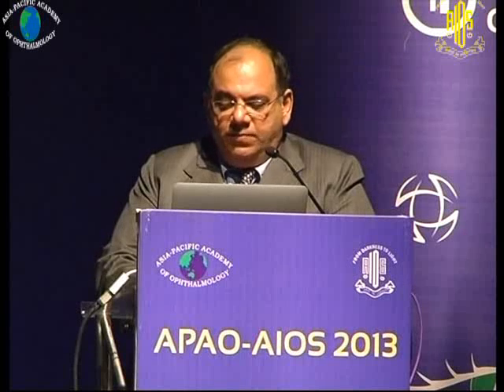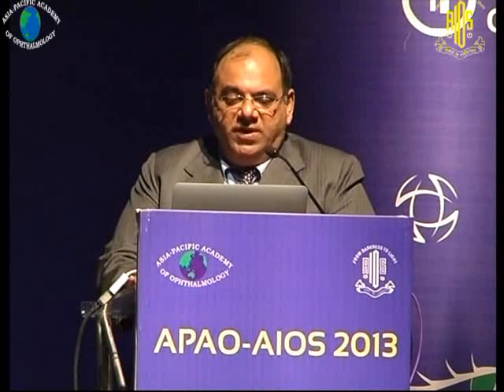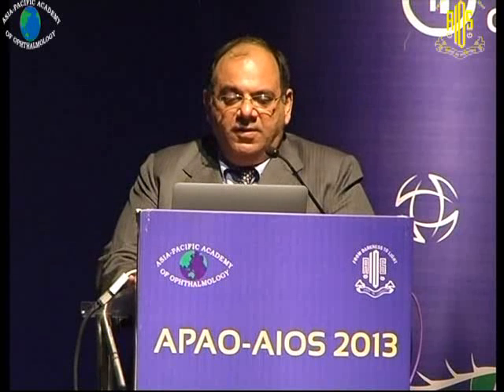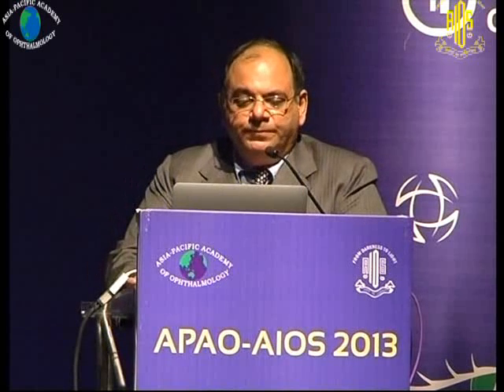There might be an excessive inflammatory response in some cases, and a shallow anterior chamber may be observed. Aggressive control of post-operative inflammation may minimize these events. Intraocular tamponades such as gas also increase the risk of intraocular lens-related complications such as pupillary capture and lens decentration. These have to be kept in mind in the post-op phase, especially with meticulous positioning and keeping the pupil mobile. Anterior displacement of the intraocular lens may induce a myopic shift in the refractive outcome.